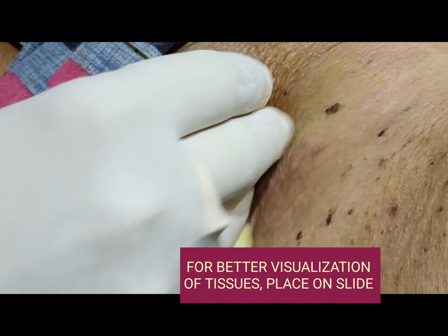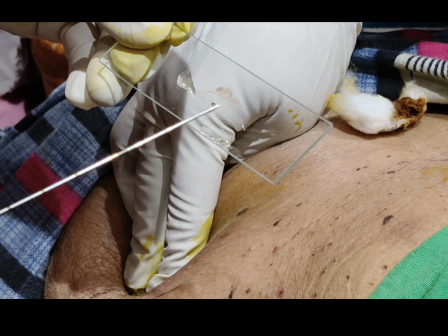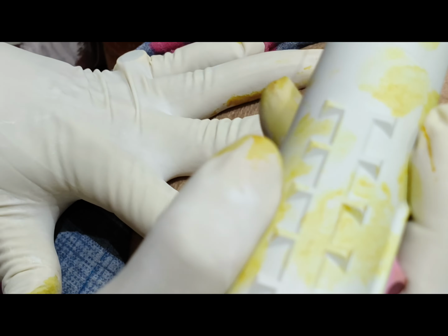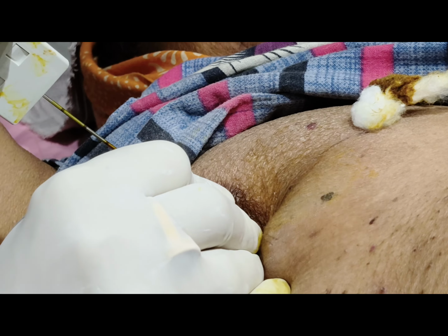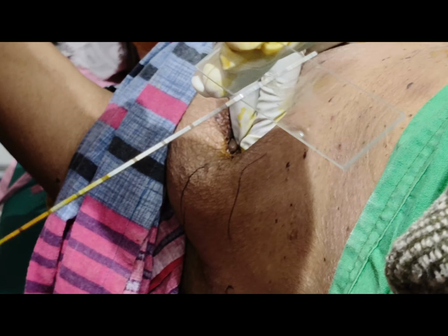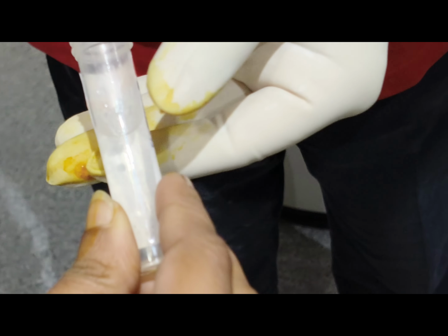There is an obstacle from rib. There are many ribs, so bony obstacles are there. So we have to manipulate the path of the gun a little bit, and we have to use the same track, always the same track. The insertion of the local anesthesia, that area we have to use every time. We have to use that skin prick site.